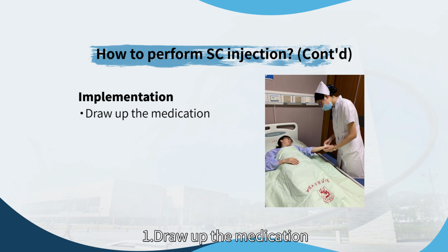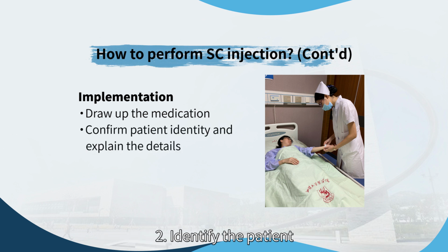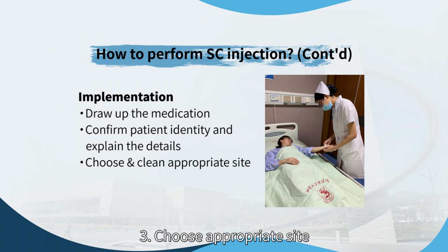First, draw up the medication according to the doctor's prescription. Second, identify the patient using two identifiers. Explain the procedure and the medication to get the patient's cooperation. Third, choose appropriate sites for injection and clean it with an antiseptic swab.